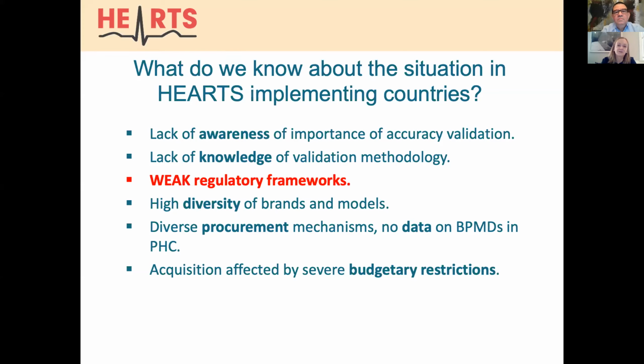And the results of these two studies show that there's a lack of awareness of the importance of accuracy validation, and linked to that, a lack of knowledge of the validation methodology.